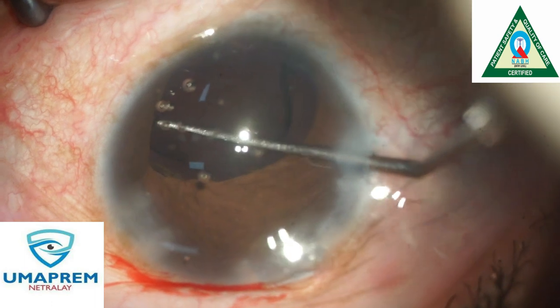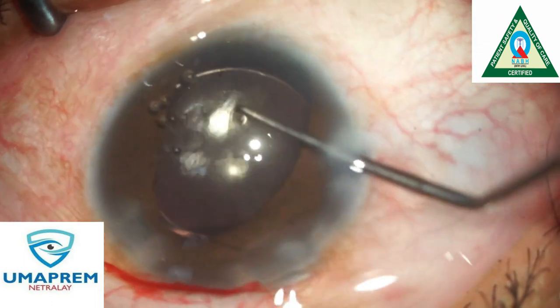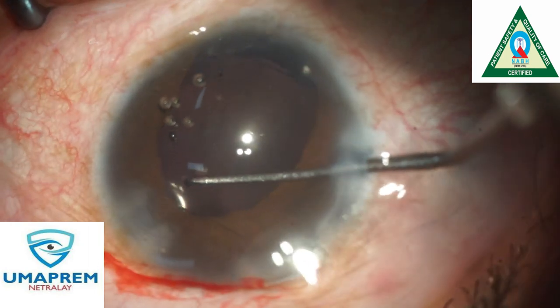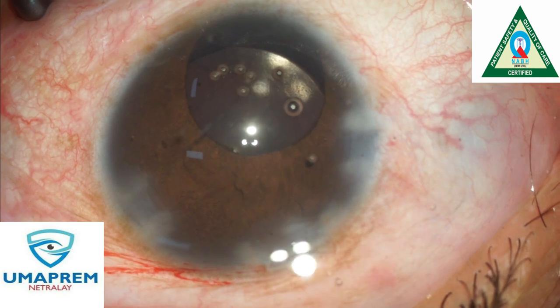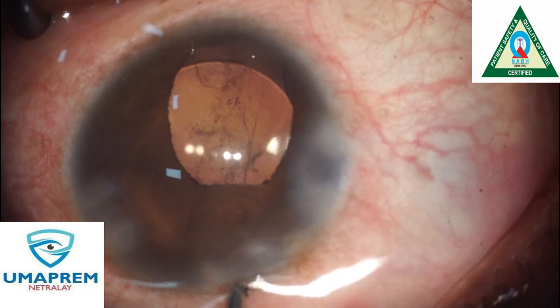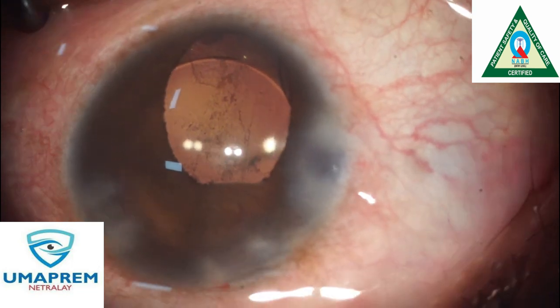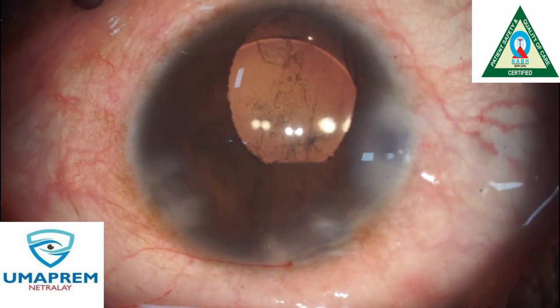After implantation — the insertion of the IOL — we rotate and tuck the lens into the bag. We successfully implant the IOL inside the capsular bag. See the clarity of the cornea — it is very clear.